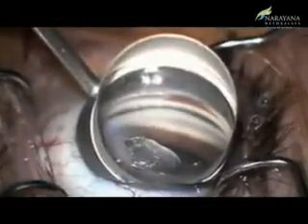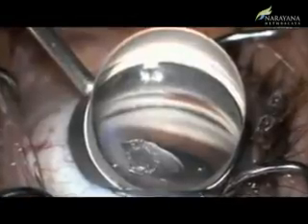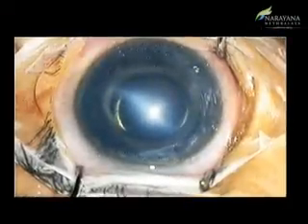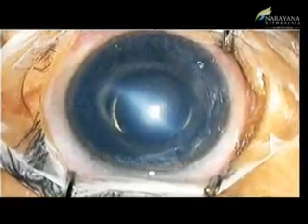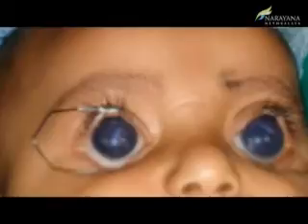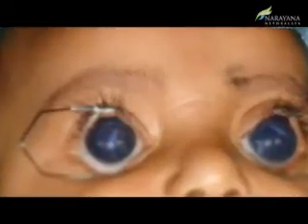OCT guided procedures at the angle do not replace the current practice of using a gonio lens, but are an alternative way to approach the angles, especially when the cornea is hazy, as in glaucoma in failed keratoplasty or congenital glaucoma. This is of great significance in countries like India, where almost all congenital glaucoma patients present with hazy corneas.